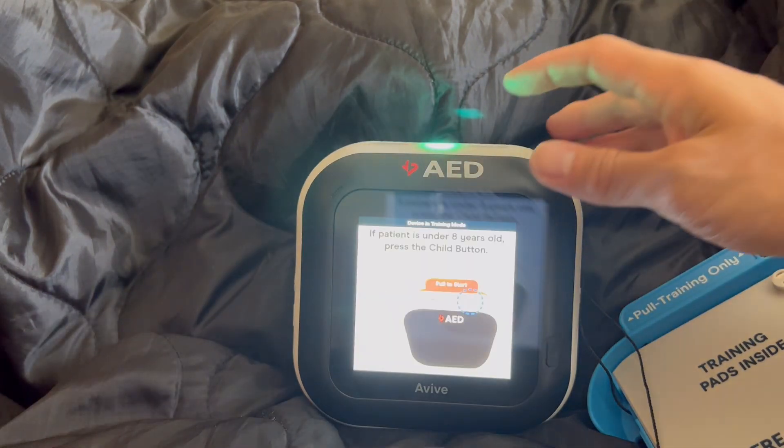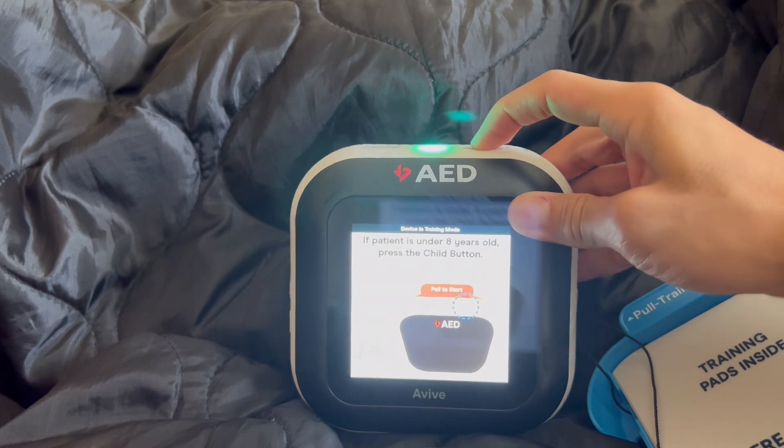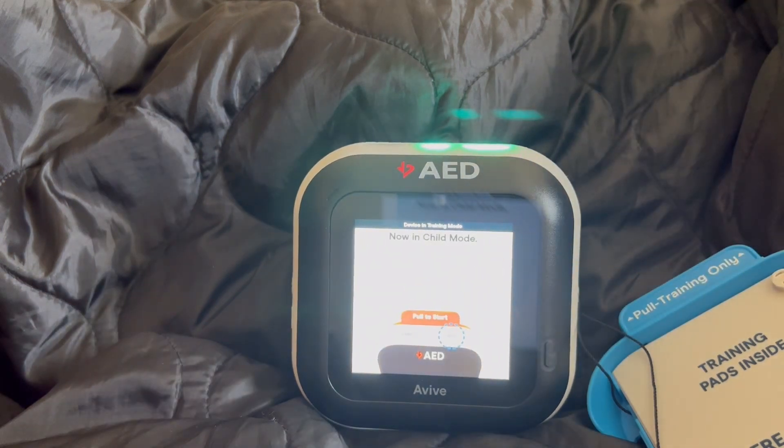Powered on. If the patient is under 8 years old, you must press the child button on the top of the device. Child button pressed. Now in child mode.